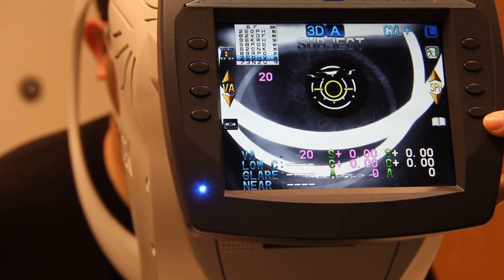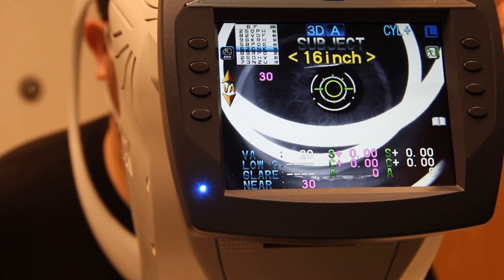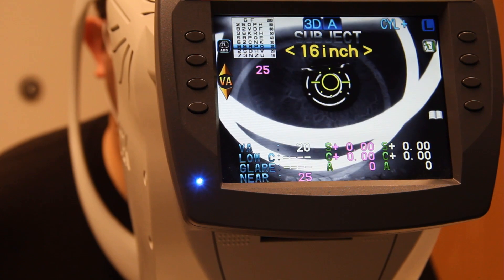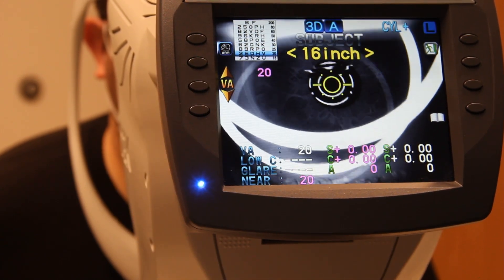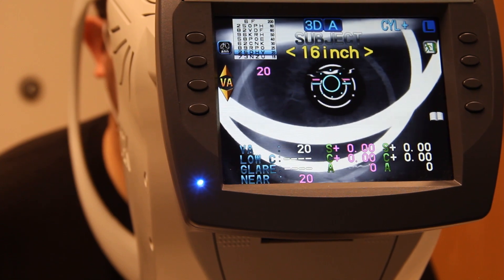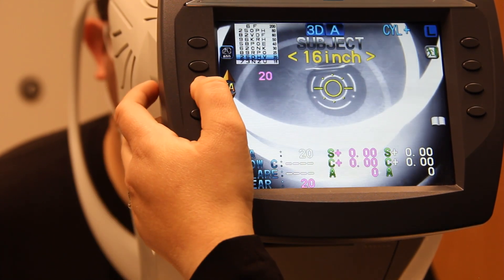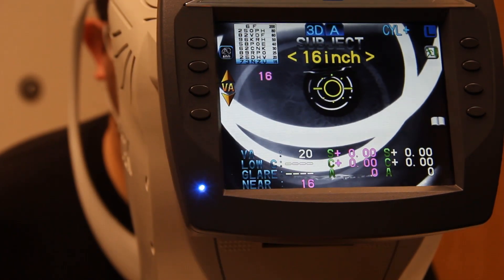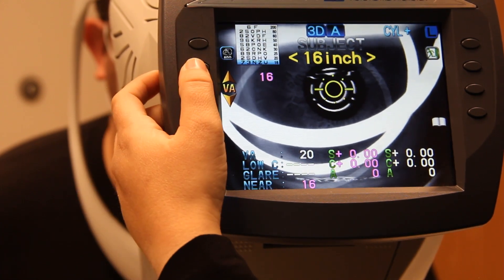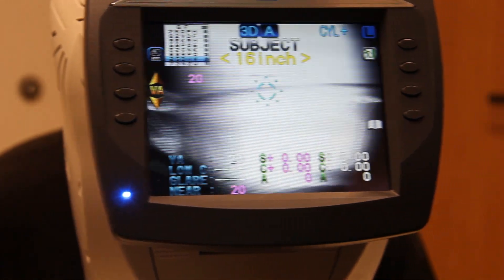Now we're going to have him read near vision — click on this little book. I like to stay on the left eye and go back to do the right eye later. Going to 2025: eight, nine, R, P, O — what about there: Z, five, O, H, I. He missed a couple on the 2020 line. Our reading doctors are okay with stopping at 2020, but ask your readers if they want you to go all the way to 2016.